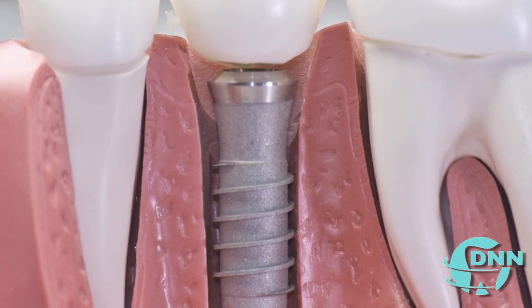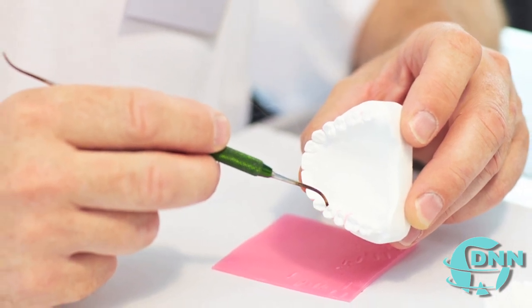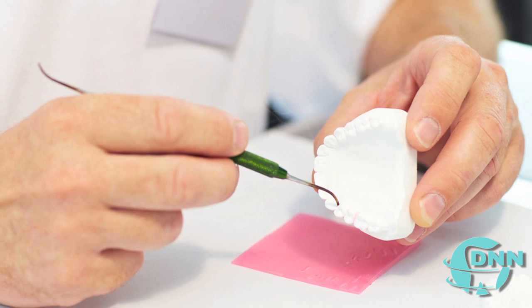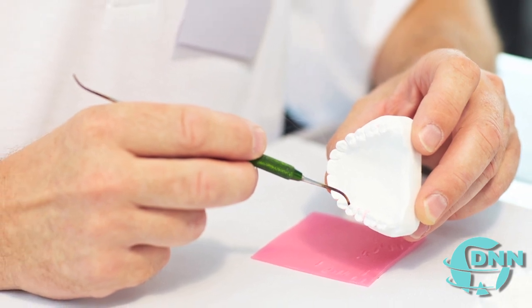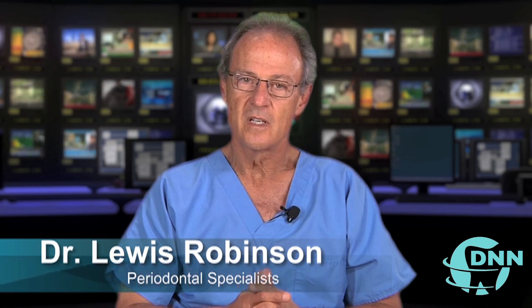It works particularly well for patients who have no teeth, what we call the edentulous patient. Patients who wear dentures, for example, can come into the office, have a grouping of implants, usually 4 in a specific array, and they can have a permanently fixed attached denture made that bolts onto the implants, screws into the implants, and they leave my office after surgery with teeth attached to their mouth.